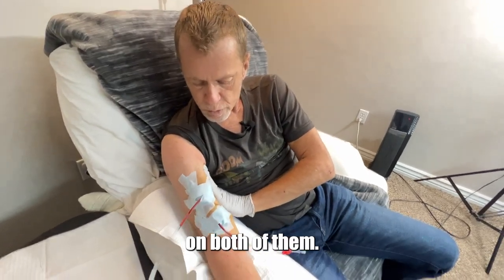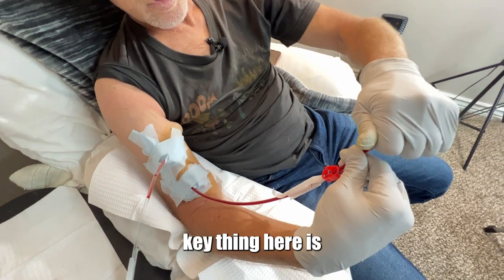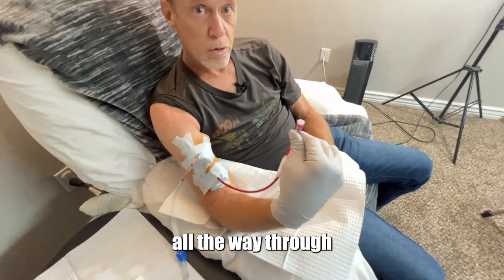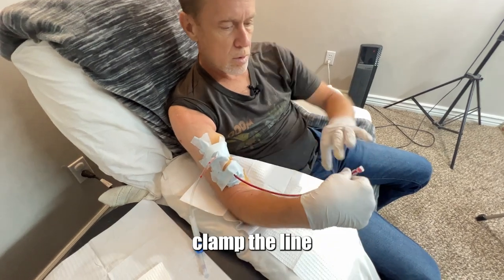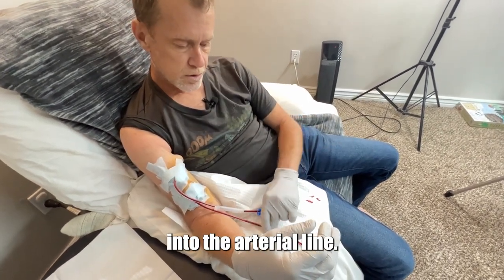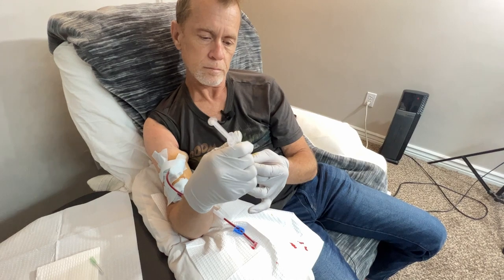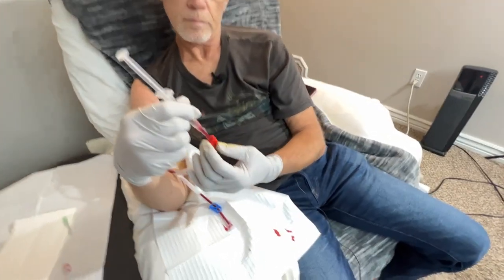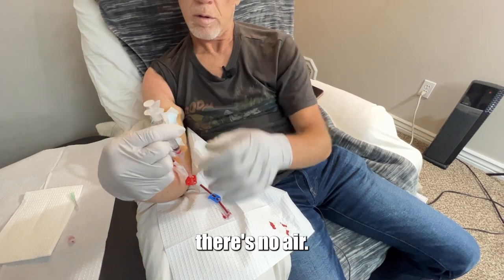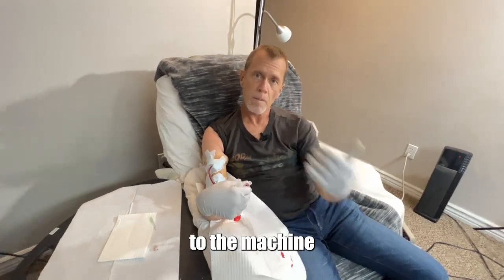Push again to make sure you have good flow on both of them. Next, I prime both of the lines. The key thing here: make sure there is absolutely no air in the top — it has to be full with blood, primed with blood all the way through. Clamp line number two. Next, I'm going to put heparin into the arterial line. Heparin makes it so that the blood does not clot during treatment.